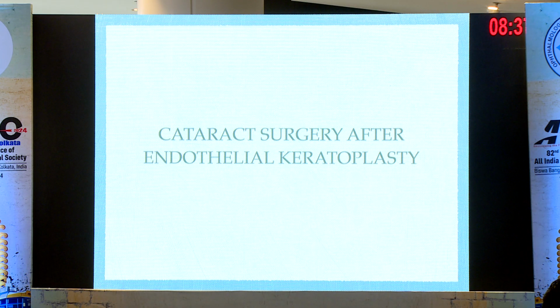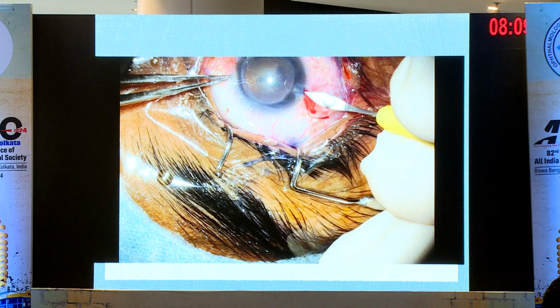Ideally, you would like to make your entry outside the DMEK graft, but I don't think it's mandatory. It's very unlikely that your phacoemulsification will detach the DMEK graft. The rest of the surgery is pretty much normal. Even for IOL calculation in DMEK, you don't really need to make much of an adjustment, because the DMEK graft doesn't have much of a refractive effect, unlike the DSEK graft, which causes a hyperopic shift, so you have to choose a more myopic power.